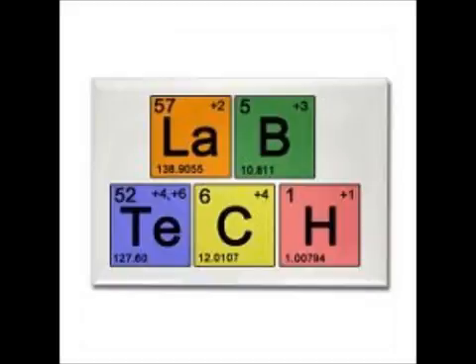So they were little cartridges you add the blood to. I don't know if it's 100 microliters or what, and you add it to both sides. And you have a little machine that reads it. And it probably detects some kind of clotting, and there's an endpoint of when you know it's abnormal. So there was one cartridge that had collagen and epinephrine, one cartridge that had collagen and ADP. And they're flagged here. On your front side, it says in there what the cartridges are. And so what I want you to know is, how do you know it's aspirin and how do you know it's a platelet function disorder?